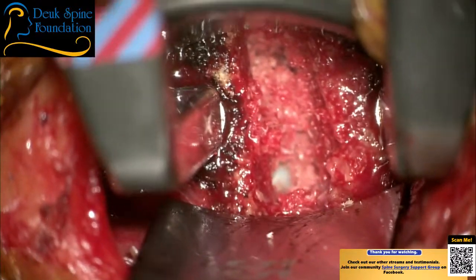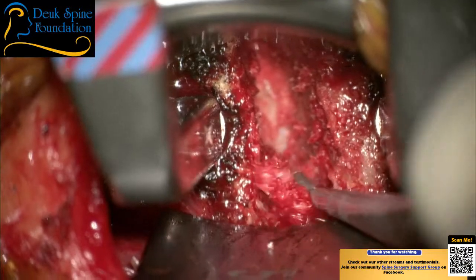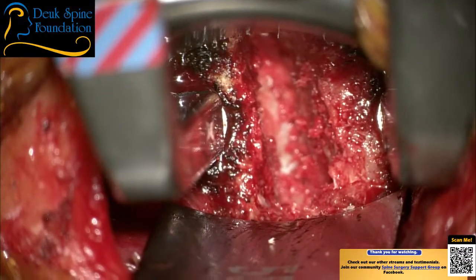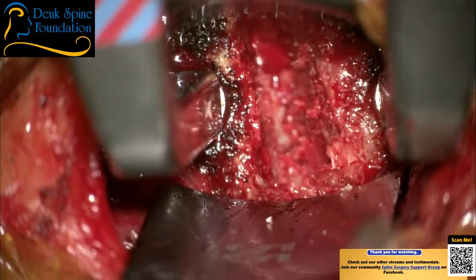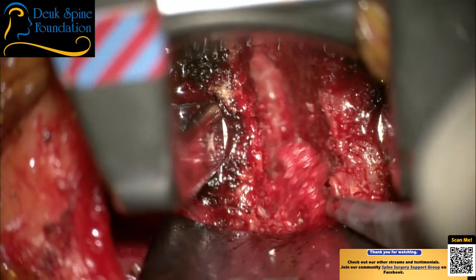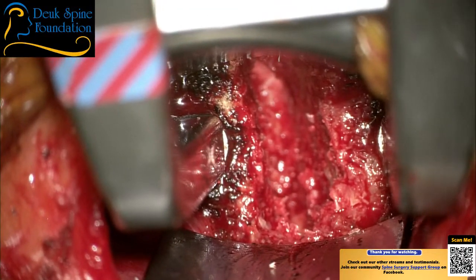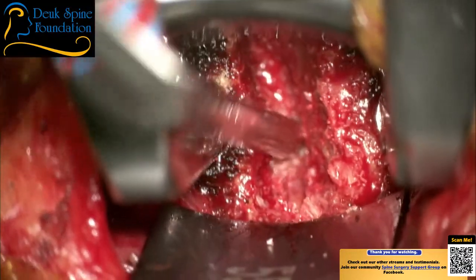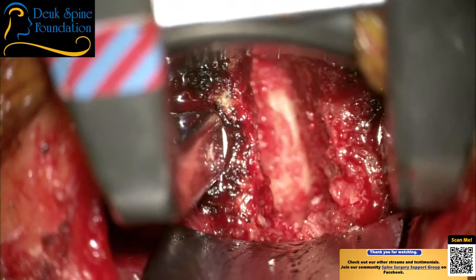Bone graft or bone remover. We're going to save some of this bone for fusing the patient. We're going to put it inside the spacer you're going to see in just a few minutes. We call that a PEEK cage. And this is plenty of bone graft. And why do we want this bone? Well, it's got lots of stem cells for promoting fusion. A lot of good stuff.